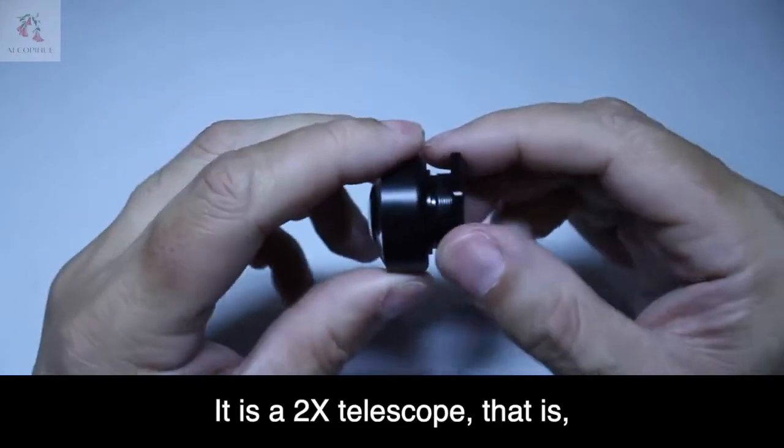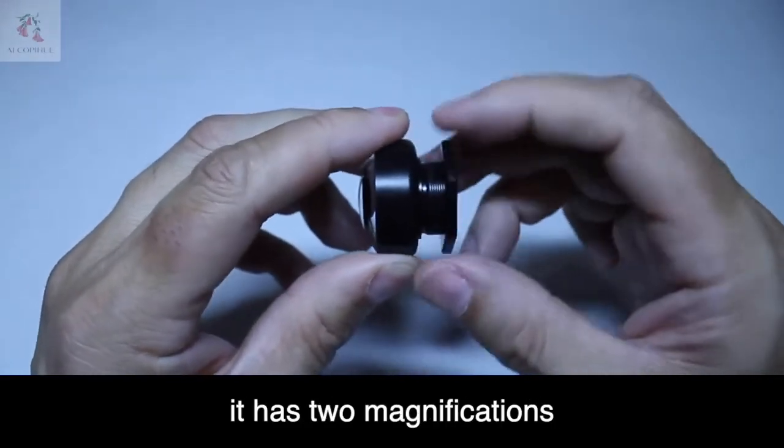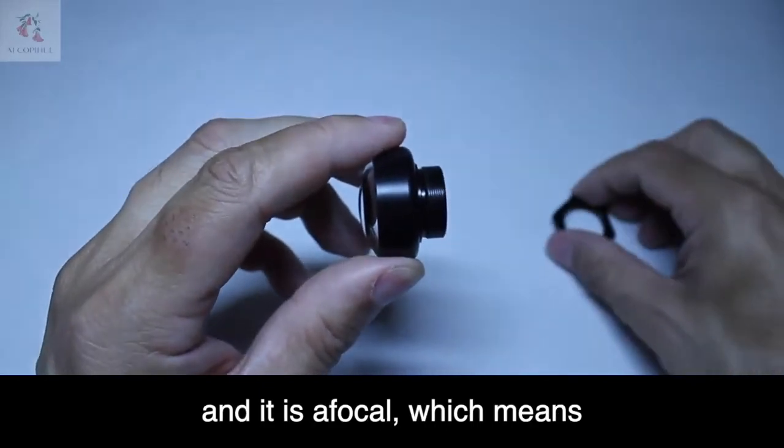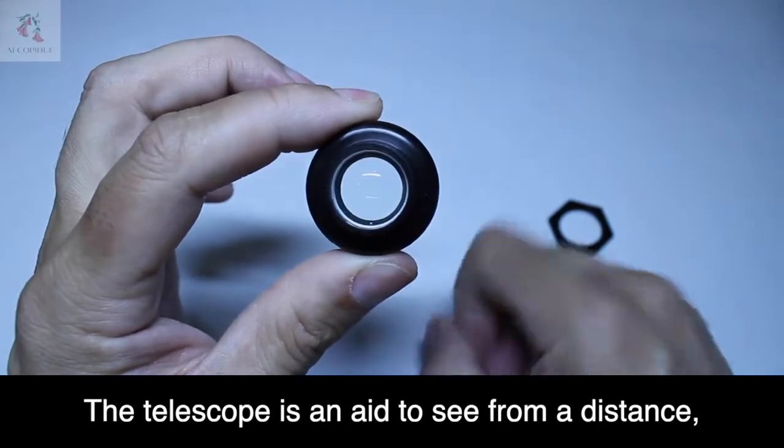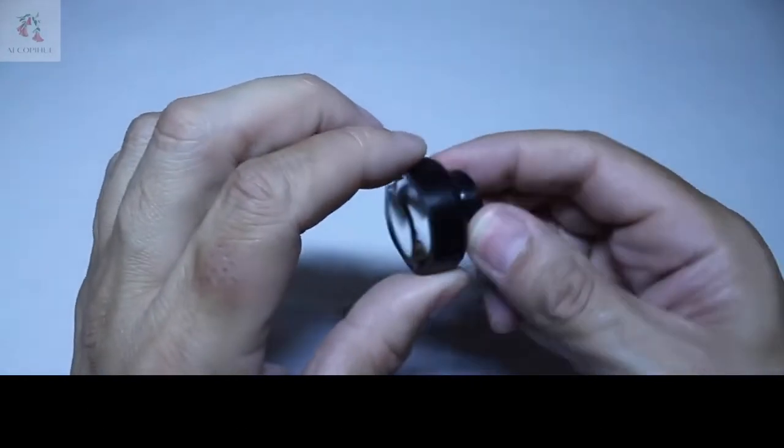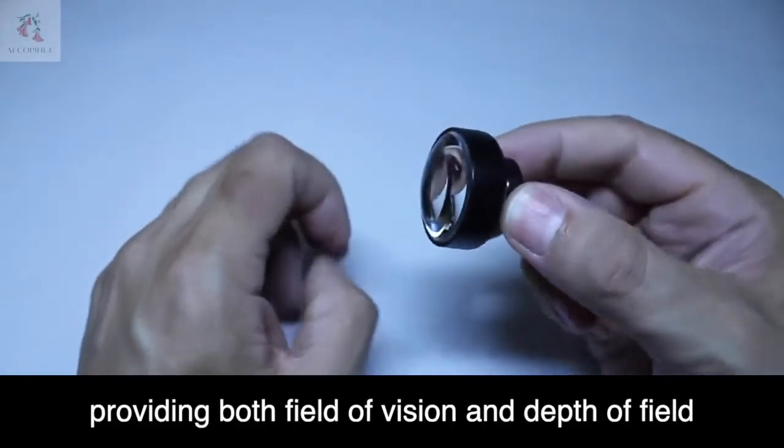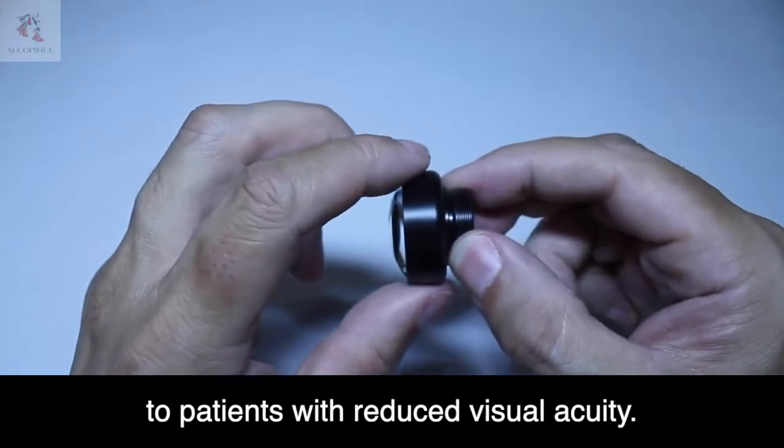It is a 2X telescope with two magnifications, and it is afocal, which means that it has zero diopters. The telescope is an aid to see from a distance, providing both field of vision and depth of field to patients with reduced visual acuity.